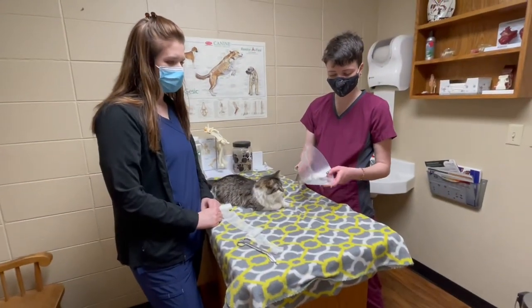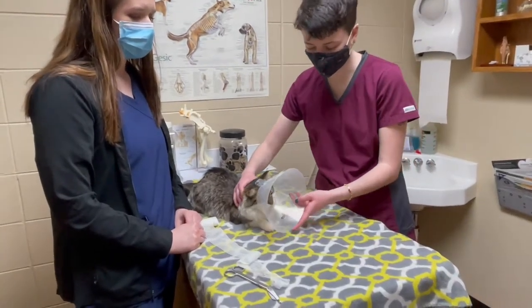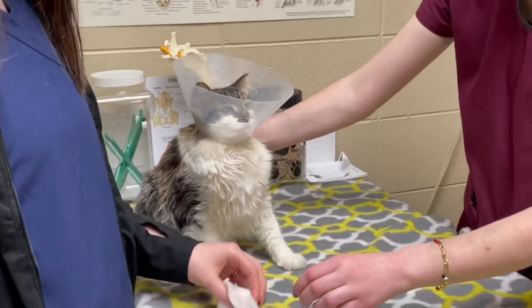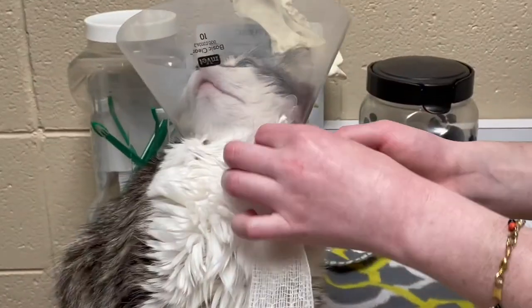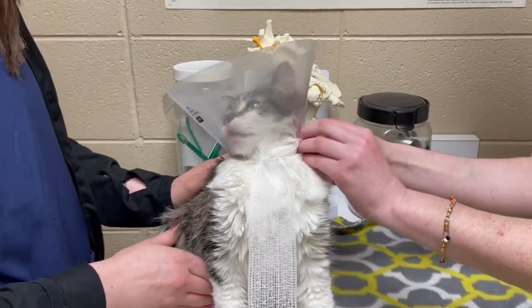All right, so now that the cone is assembled, it should be loose enough that we can just slide it right over his head. And then, because he would obviously be able to get that off really easily if he wanted to, we're going to take some of this gauze and these loops — if you see these here, that is what we assembled before — we'll pull that gauze through. Of course he has lots of hair so it's a bit difficult.